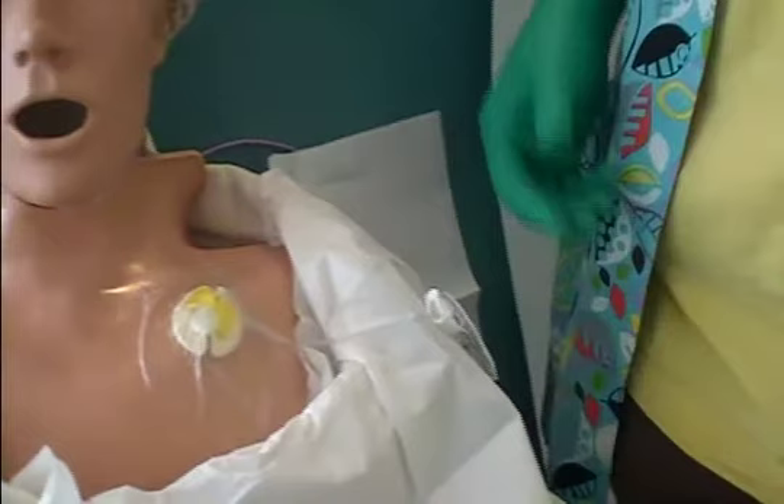So we've finished that — we got our blood. We're going to go ahead and start using this for infusions or blood draws, whatever we need. Each time we go to access this, we're going to use a side scrub and scrub that end before we put a syringe onto it. The side scrub comes in like this — it has a whole bunch of little spongy things in there. You put it down in there and scrub it, and it scrubs the inside as well as the outside.